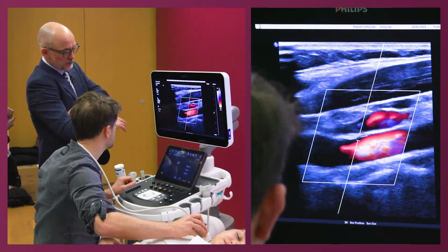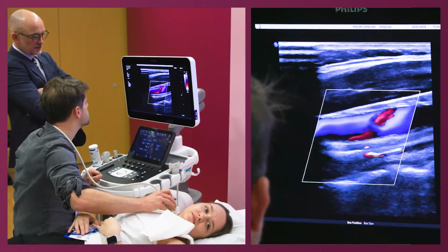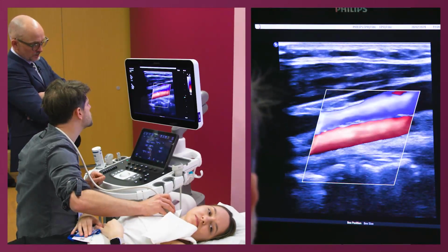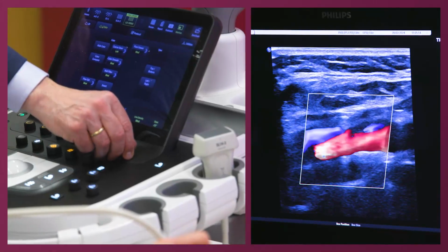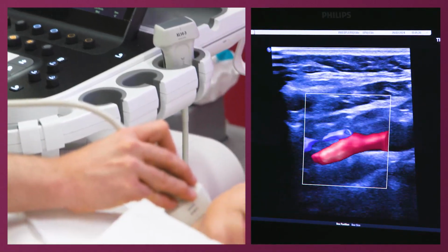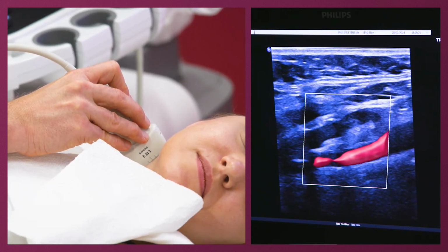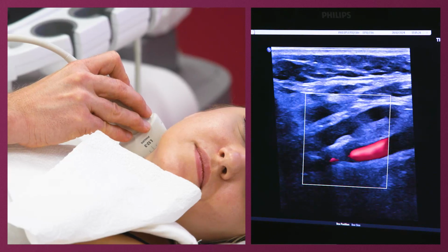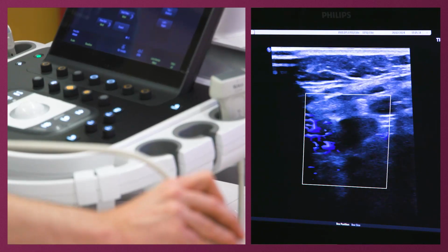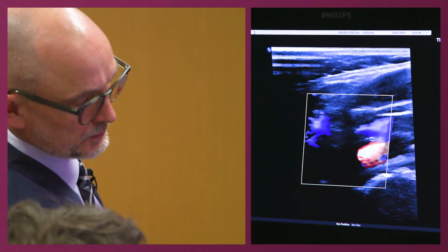So before you start that, I think you should see in the color if you can see any plaque. Yes, plaques, side branches. Sometimes I turn this around. I think this is external, probably, but I would like to see a side branch. I never decide beforehand which one is the right one. I need to see a side branch. I need to see the flow curve. How do you do it in transversal? No, never. There's a steering button here, so you can do it like this.